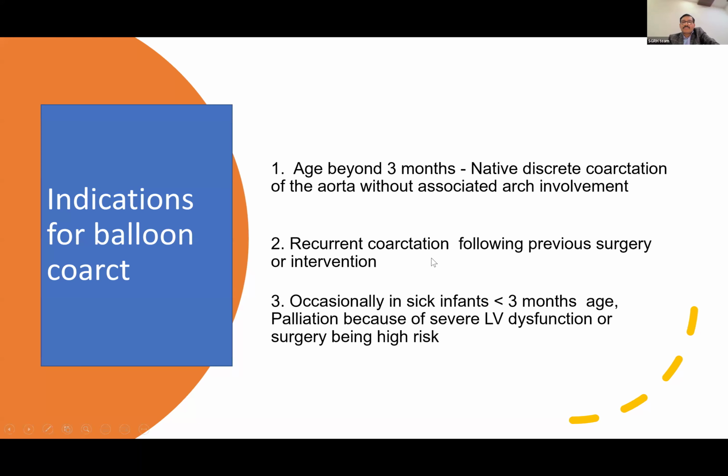Recurrent coarctation after surgery or intervention, we all know this. And less than 3 months of age, if it's palliation, because surgery is high risk or there is severe LV dysfunction. Nowadays, a lot of surgeons are comfortable going for surgery with an LVEF of more than 30%. So in our unit, only if the LVEF is less than 30% do we go for balloon dilatation, otherwise not.